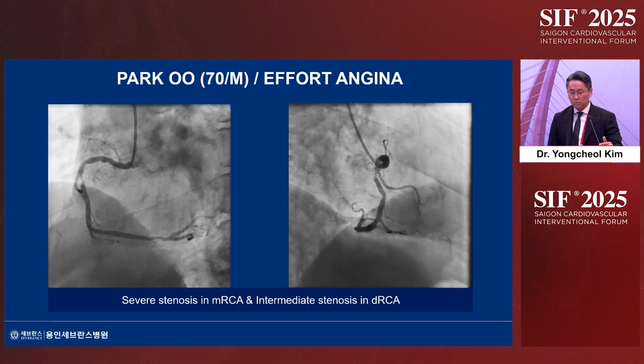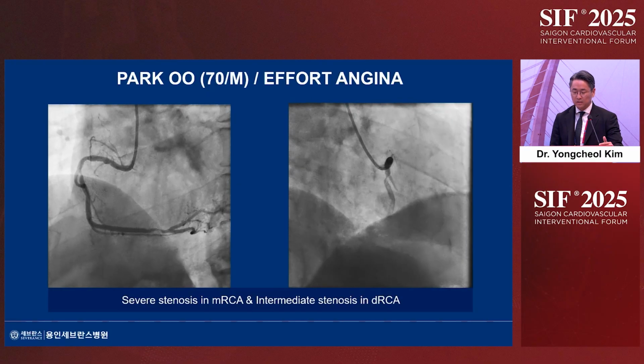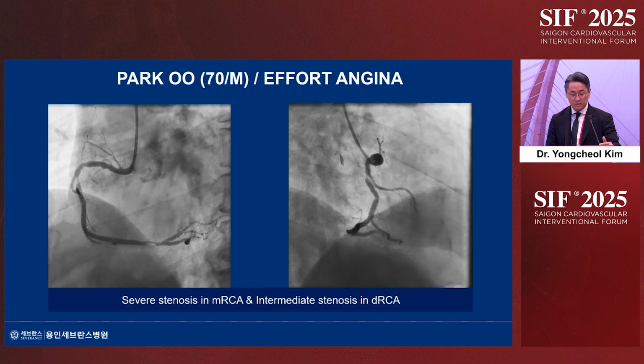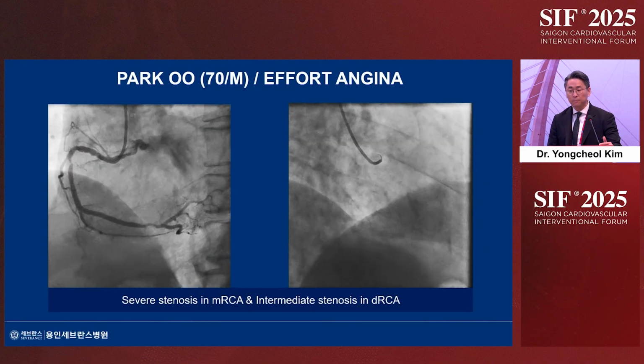So I'd like to show how I perform AI-QCA assisted PCI in my daily practice. It's a 70-year-old gentleman who complained of effort angina, and the angiography showed severe stenosis in the mid RCA and intermediate stenosis in the distal RCA.